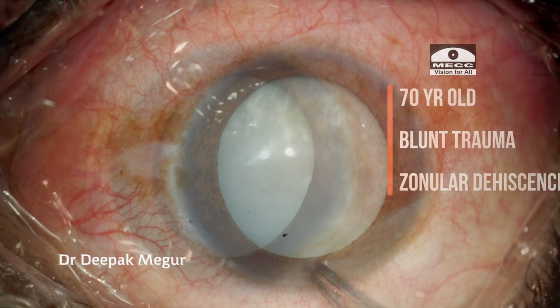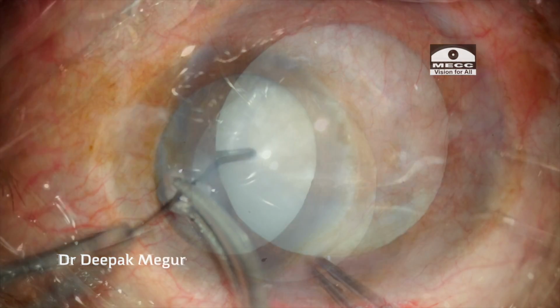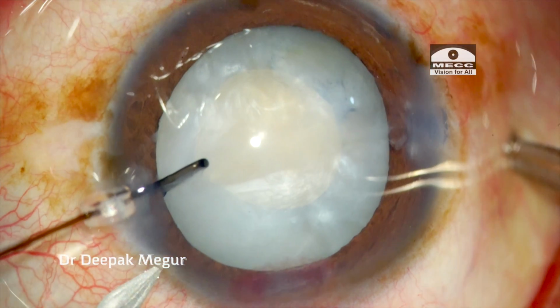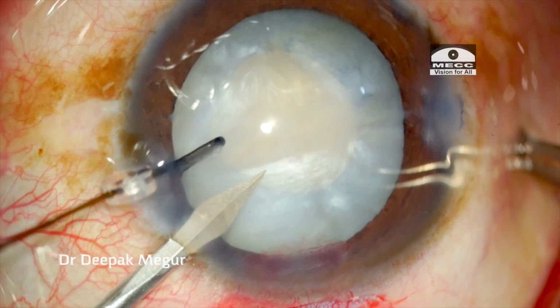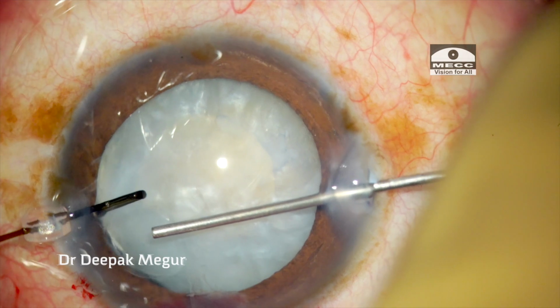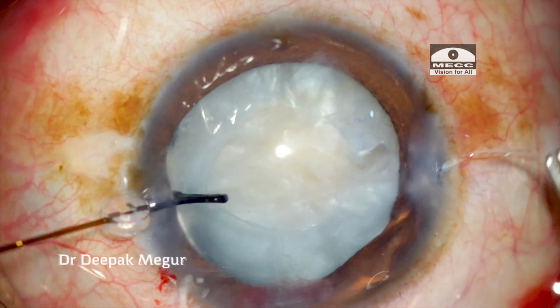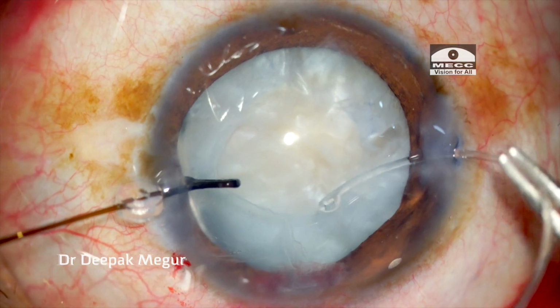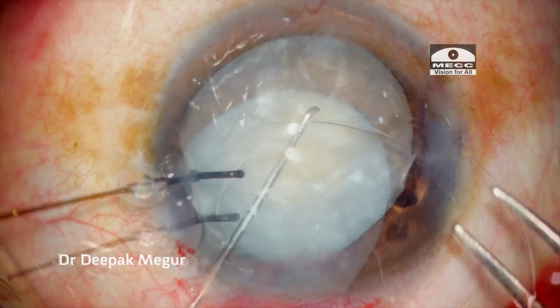Now moving on to the next case, this is a traumatic subluxated cataract with 3 to 4 clock hours of zonular dehiscence. And after the rhexis is done, I have placed a capsular hook to support the area of zonular dehiscence. After creating some space under the anterior capsule, I am using the CTR. I'm trying to negotiate it and gently manipulate it.